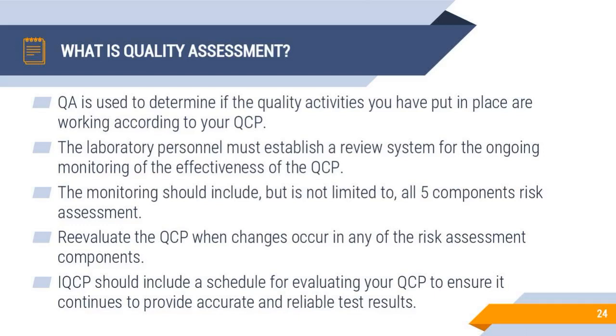For example, if I said we have to do the maintenance twice a week for this analyzer, then the assessment here is to review that the maintenance is being done in good shape and on time. This is the review. Whatever I put in the plan, I have to check the records. I have to review the records to confirm that everything has been met and done.